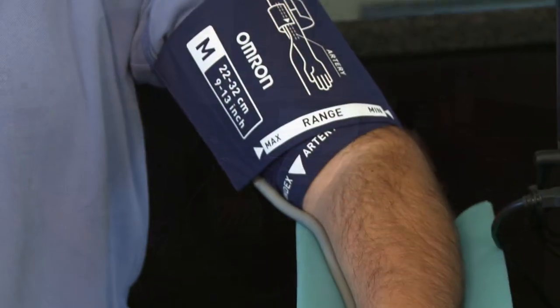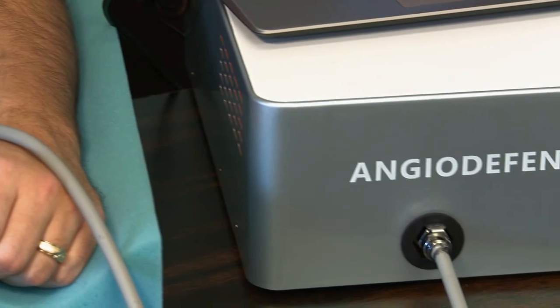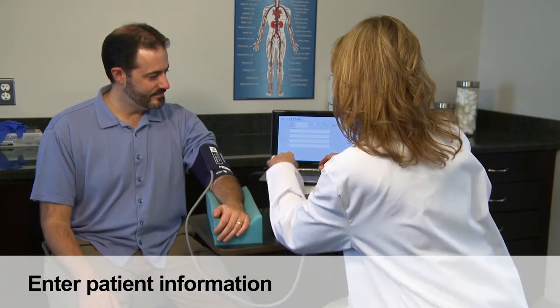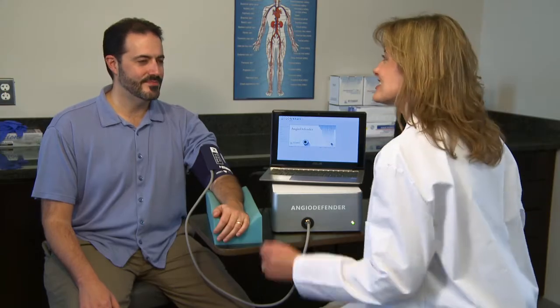In particular, the patient should not move the arm that the cuff is on, and should remain still and quiet during the rest period and during the active testing. While the patient is resting, patient information can be entered into the Angio Defender system.